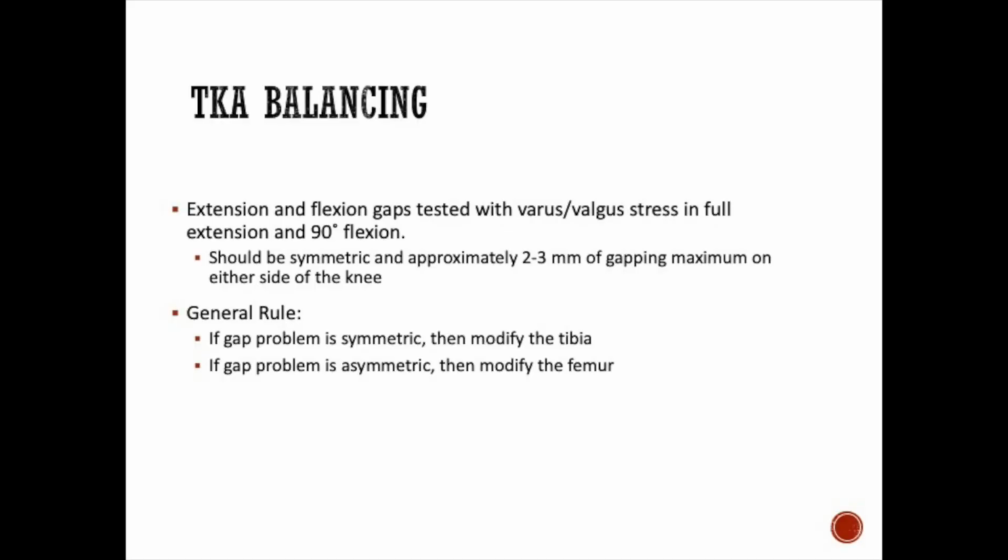So ideally, when you stress in varus and valgus, both in extension and 90 degrees of flexion, you want about 2 to 3 millimeters of opening up and gapping of that joint line.